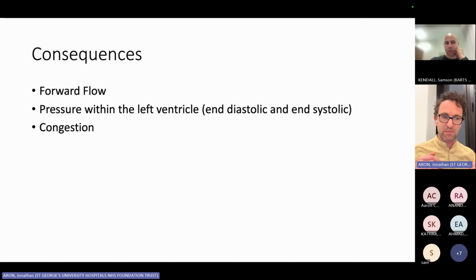I'll just make my first point. Get a few cycles, freeze it, scroll back and forth slowly. Look at the ECG, look where you are in the cardiac cycle. Is the aortic valve fluttering? Is the mitral valve being dragged into the left ventricular outflow tract? Is the left ventricular tract narrowing in the middle of systole? So look for it, actively look for it.